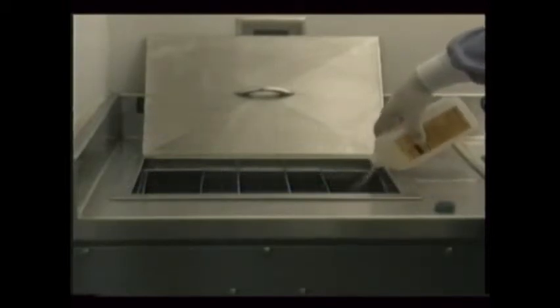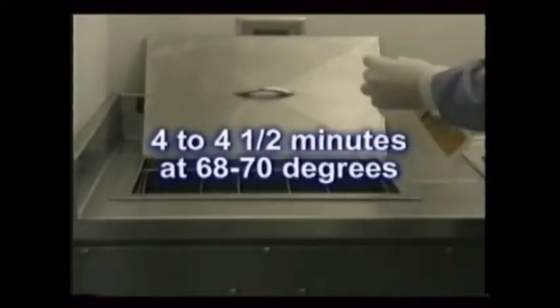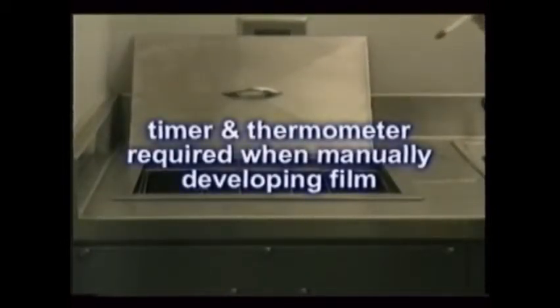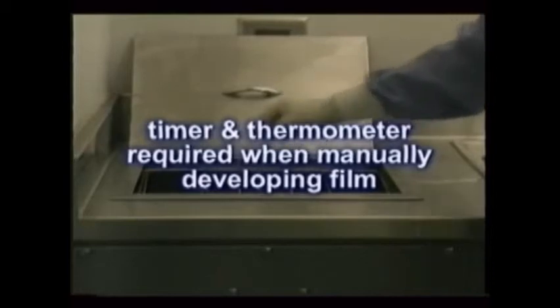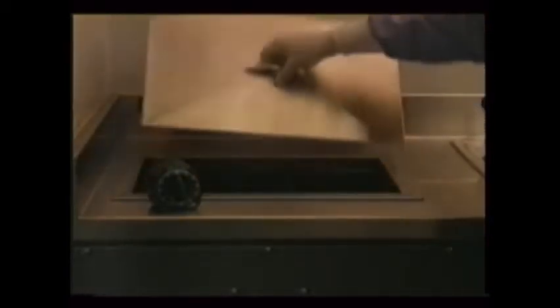Manually, the process involves dipping the film in the developer for 4 to 5 minutes at 68 to 70 degrees, depending on the chemicals. Naturally, this can be accomplished only if you have a timer and a thermometer, both required by law when manually processing film. Sight developing — immersing it just until you see an image appear — is prohibited. You must time it.